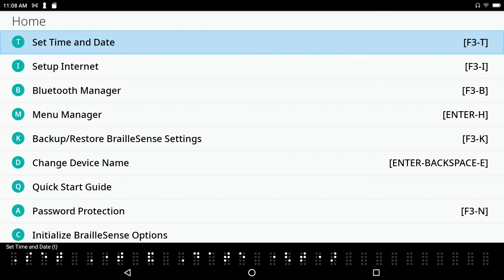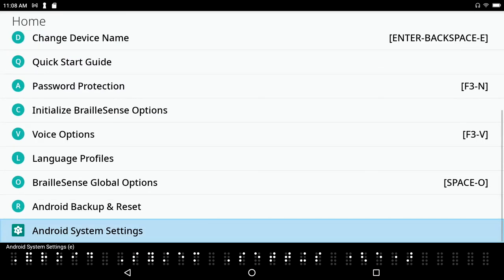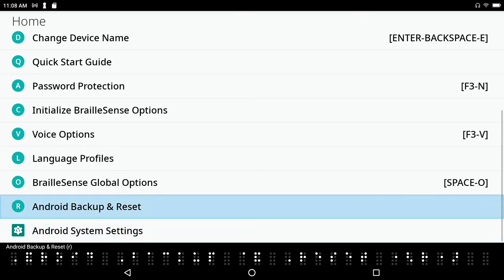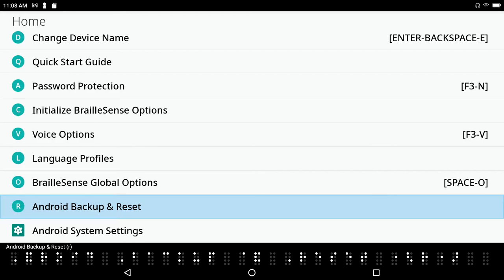I'm just going to go ahead and go down to the bottom with space 4-5-6 because I know that down towards the bottom here we've got Android backup reset. That will not do you any good in regard to saving a backup in the hopes of putting it on your BrailleSense 6, so let's not bother with that.